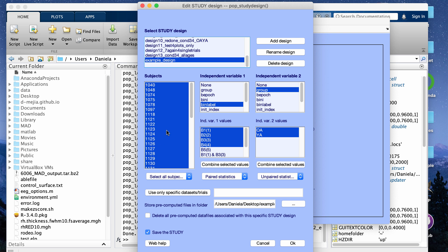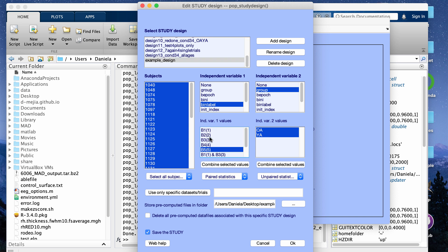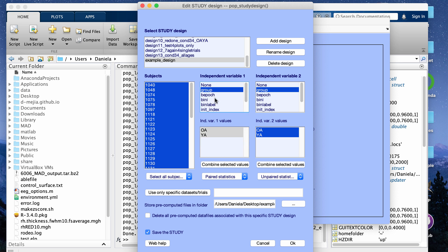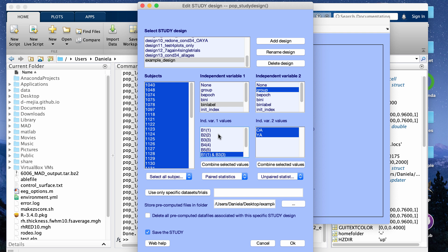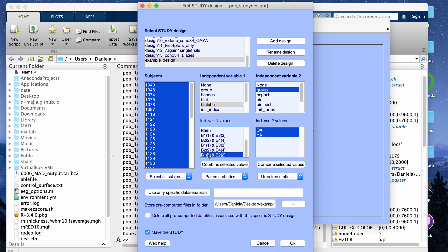For my data, I have a variable called 'bin label' with five different conditions studied during the EEG study. When I click that, it loads in. I want to study the first four conditions, and since these are repeated measures I'm going to call these paired statistics. EEGLAB also lets you combine across different levels of a factor — for example, you can highlight conditions 1 and 2, click 'Combine Selected Values', and that creates a combined variable including both B1 and B2.